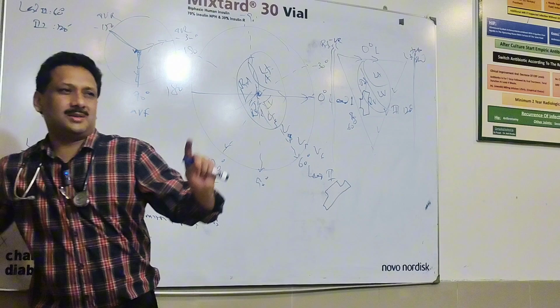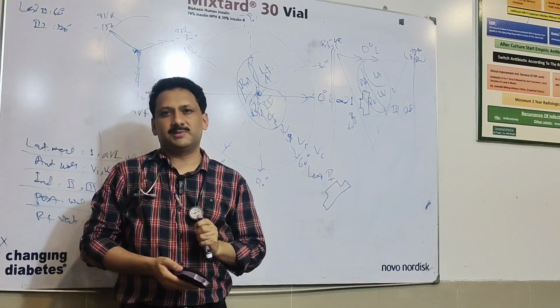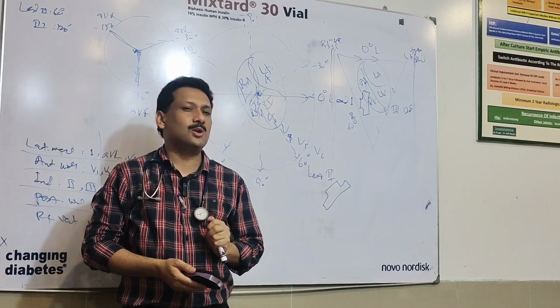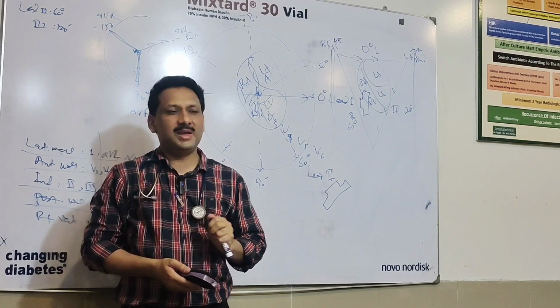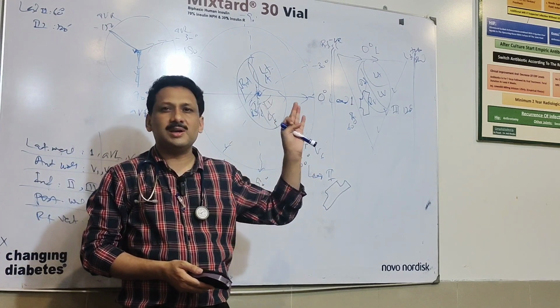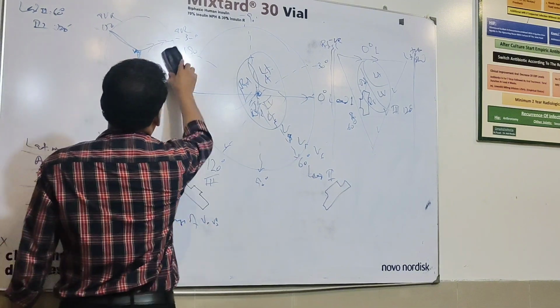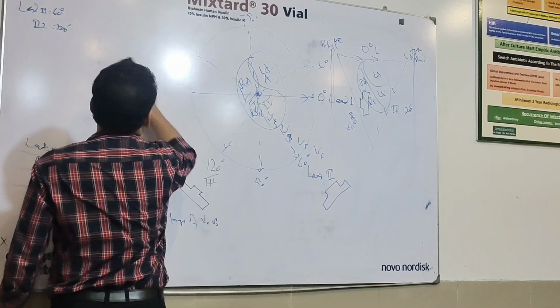So the point is, we need to draw these 12 leads. Why do these leads look different? Based on this whole circle, this whole idea, it will be so easy for us. Before I jump to this point, I just want to highlight something about these waveforms.